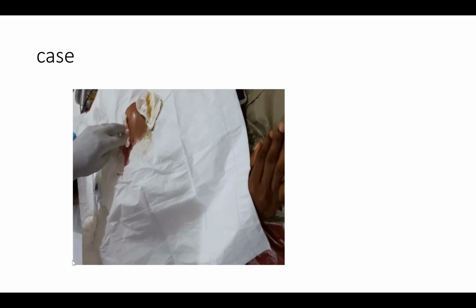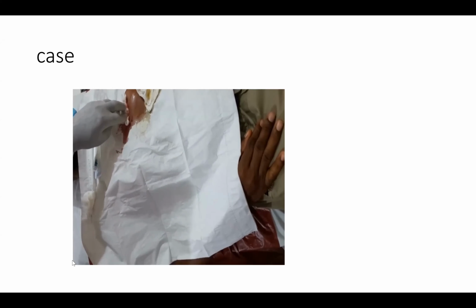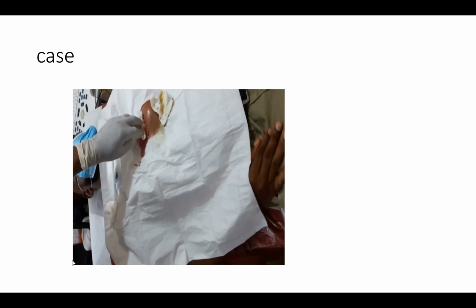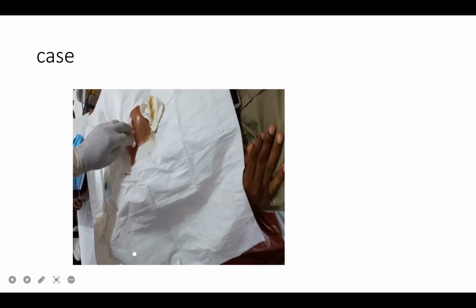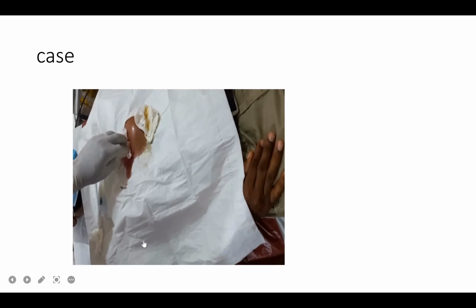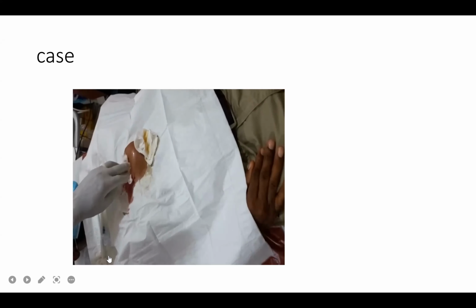That is what we usually do here, 45 degrees towards the apex, in order to get very good R waves. So we use both Medtronic, that is the Reveal, and we have also done one or two St. Jude, but it's mainly Medtronic that we try to use here. We do almost all the cases in the office. We don't go to the cath lab to implant a loop recorder.